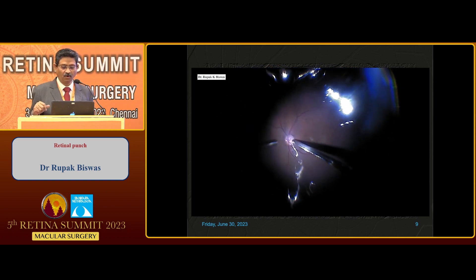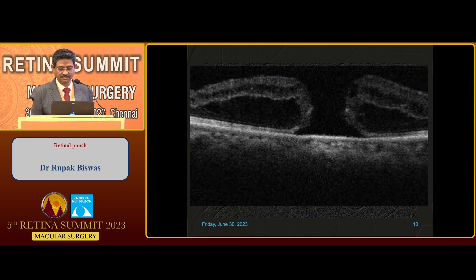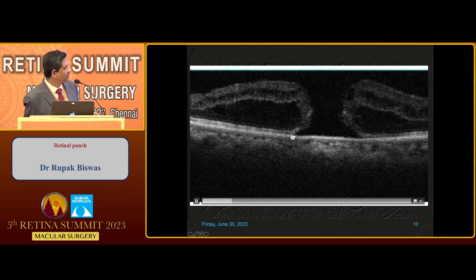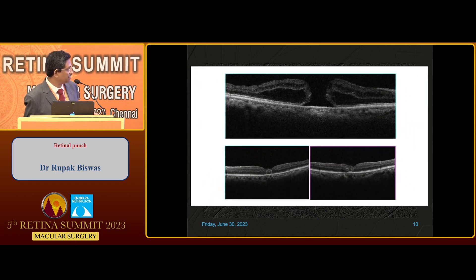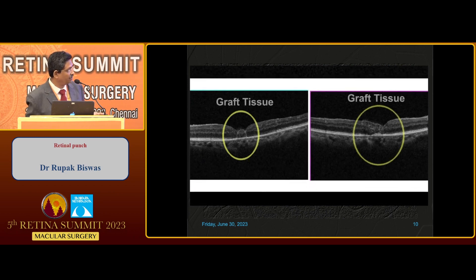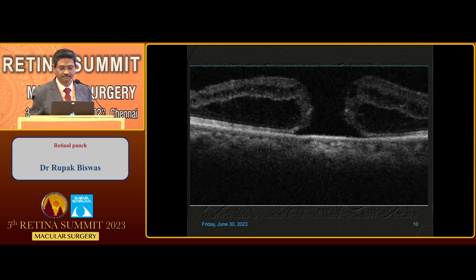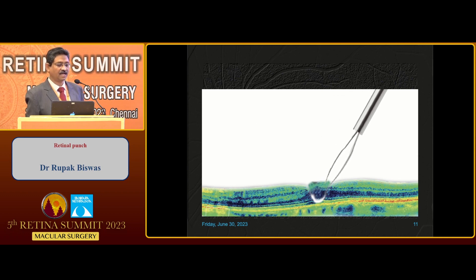The most important point is the exact size of the graft. The second key point is that when you take the graft, there is no margin that is laserized or cauterized, so the tissue is still viable. The main purpose of this approach is visible here — you can see the anatomical integration of this graft with a similar kind of tissue architecture.